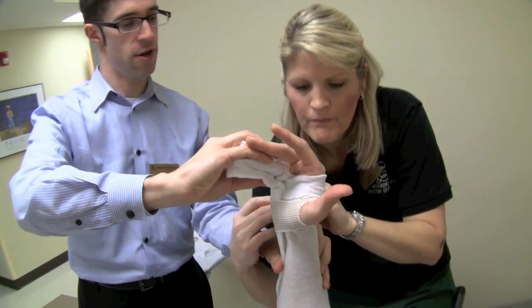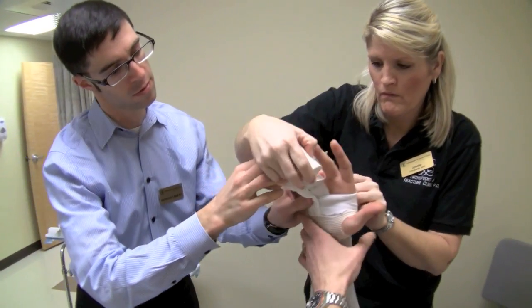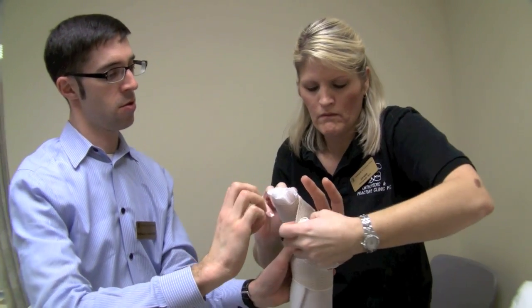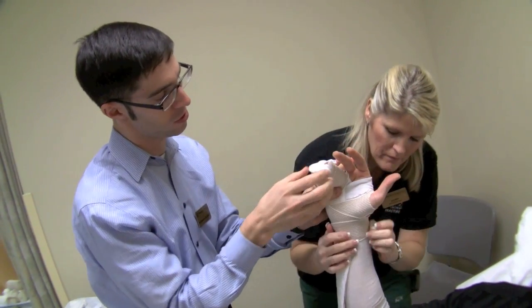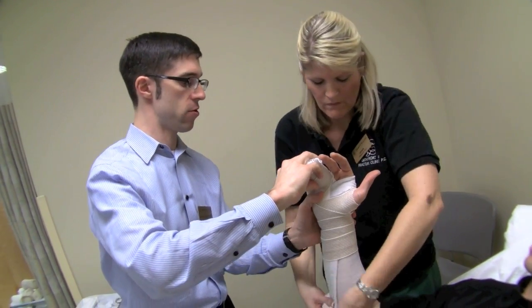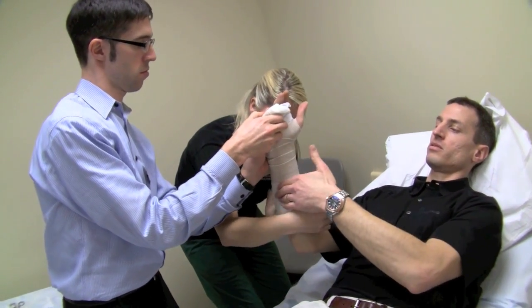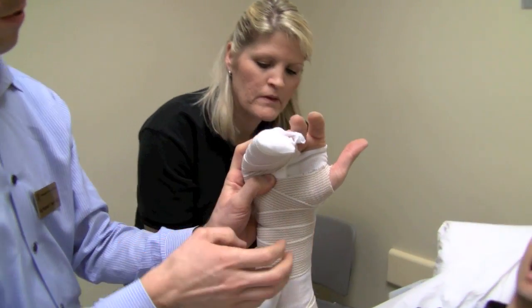As with any splint, try to avoid any major wrinkles. Janelle does a great job — starting right at the thumb opening as the anchor point, going a few wraps around the wrist, now going over the fingers. This splint seems a little small; for someone this size a four-inch splint might work better because you can get a little better wrap over the ring finger as well, depending on whether you're just immobilizing the fifth metacarpal or there's something going on with the ring finger too.